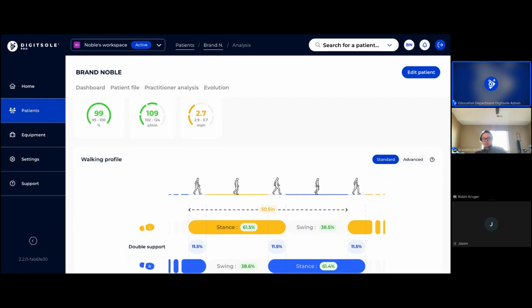The other option is self-selected speed. So that's where we tell the patient, listen, I want you to walk at a comfortable pace, but with intent, as though you needed to get someplace without being late, right? And the reason that's important is it's a really simple but powerful test, especially as we get into middle to older age adults, of morbidity and mortality.